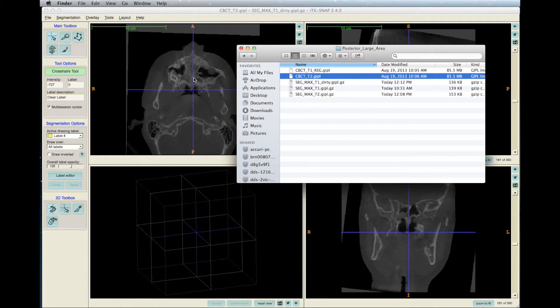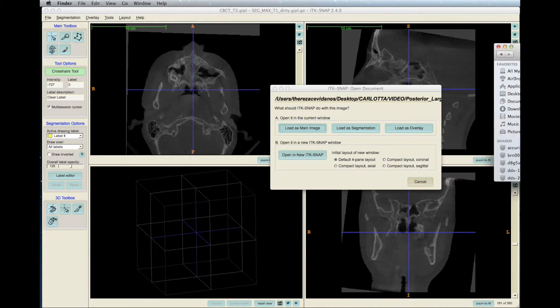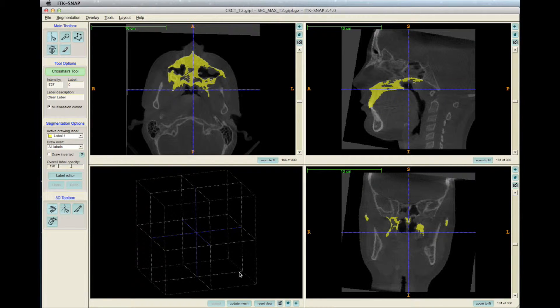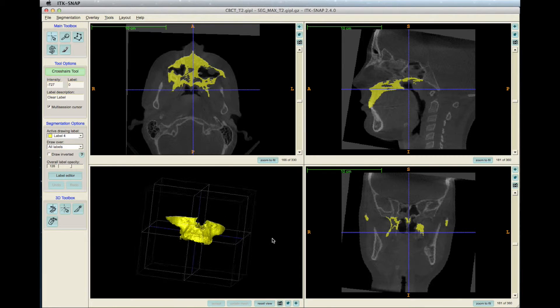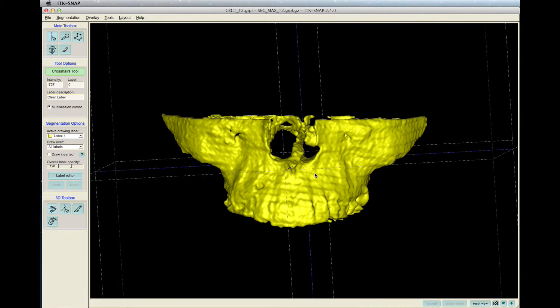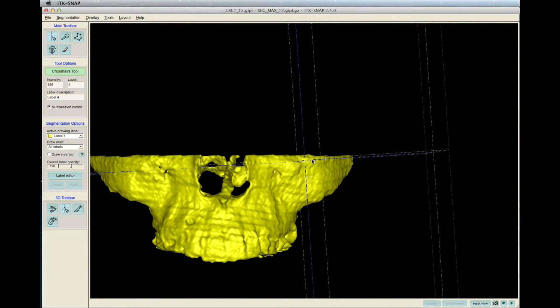Load the T1 scan and T1 maxilla segmentation into ITK-SNAP. Click Load As Segmentation and then click Update Mesh to see the 3D model of the maxilla. Now we need to cut off some regions of the maxilla to just have the posterior region of reference.